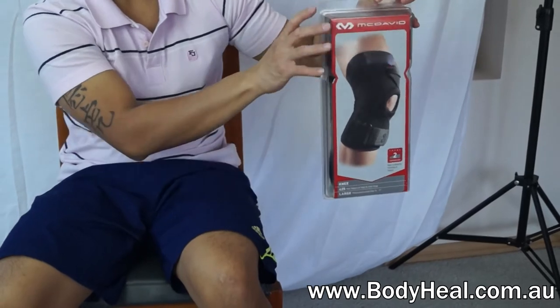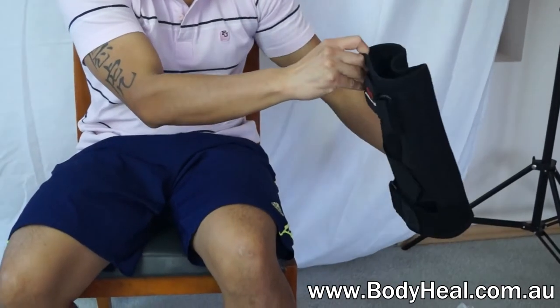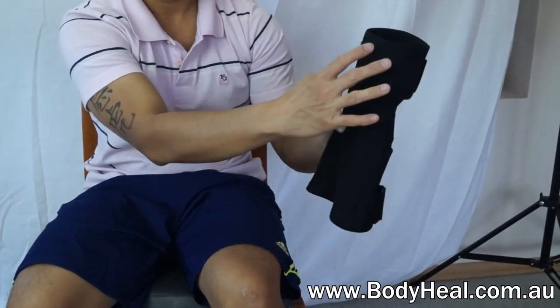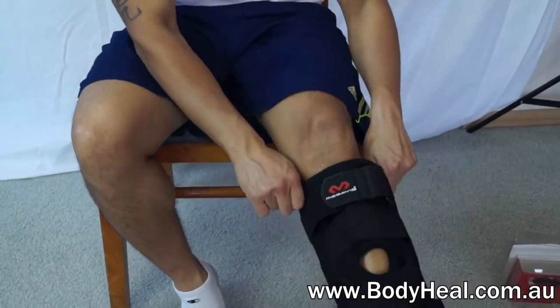The McDavid Ligament Knee Support 425 is designed to aid recovery from injury by reducing pressure on the ligaments when bending the knee. As you can see, the spring steel stays run medially and laterally and aid in prevention of ligament injuries.